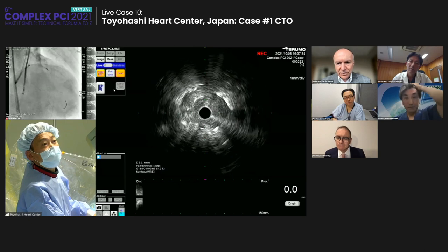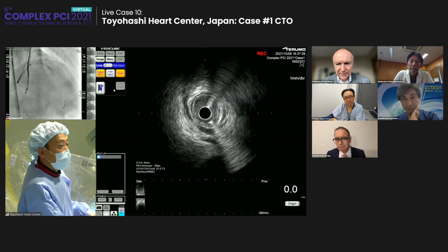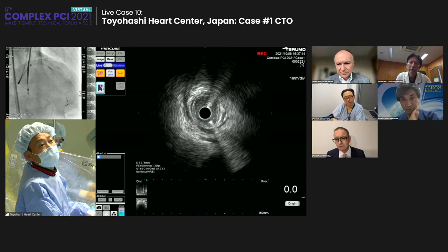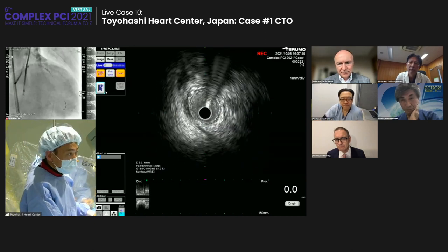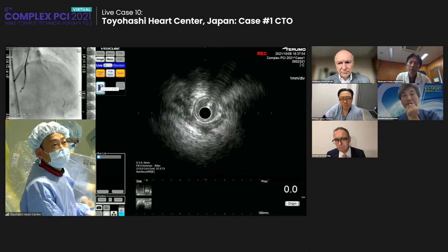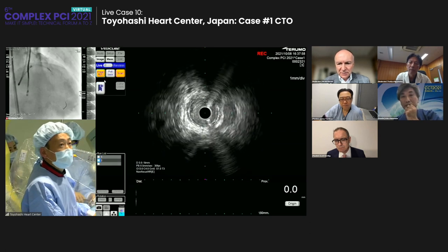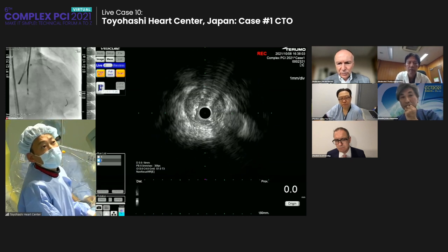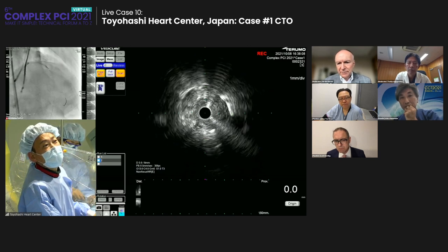Yes, you do a recording, and then we. Yes, I can show you the live images. Now the IVUS is located in the distal lumen, so you can see that. But even the IVUS, I cannot advance around there. So there is a very diffuse region, I think. Was this the wire that we saw? Was the old wire here? I can show you the IVUS images around there. Maybe we can see something.